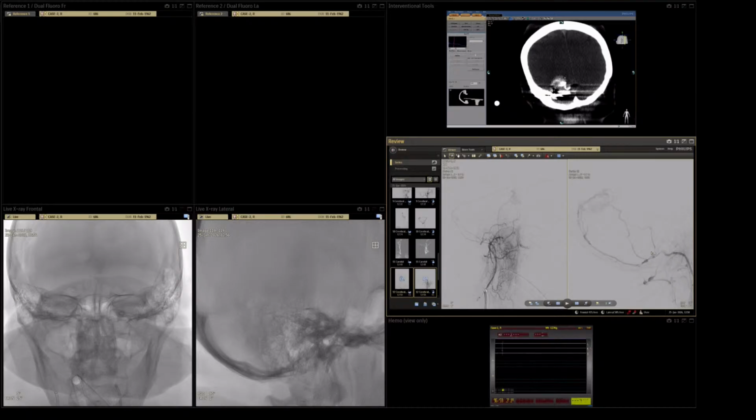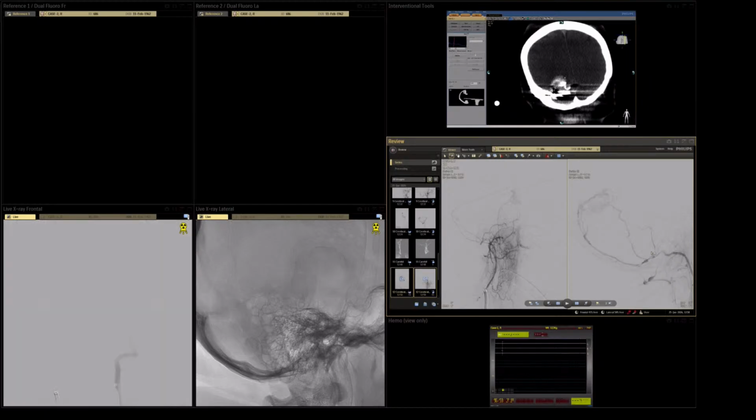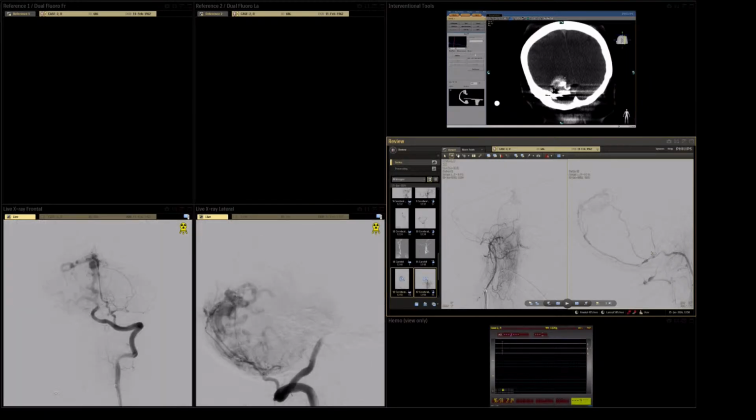Okay, now let's do angio from vertebral and then we'll check the PC. Okay.